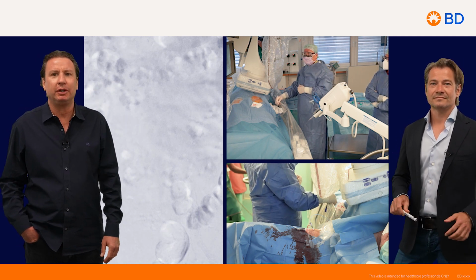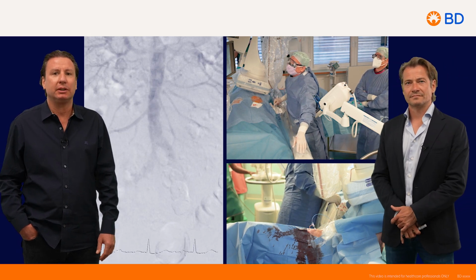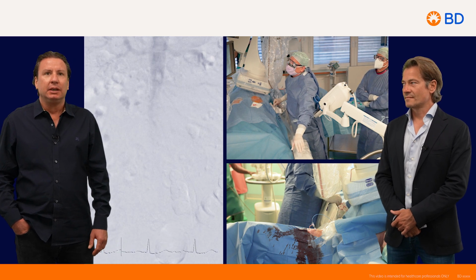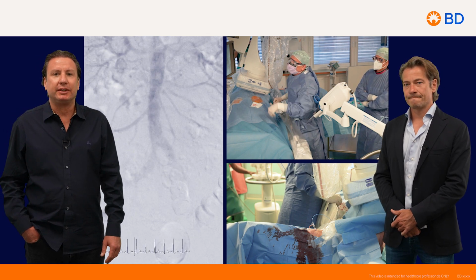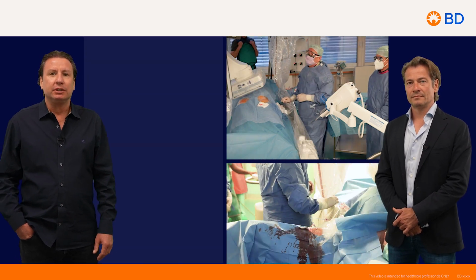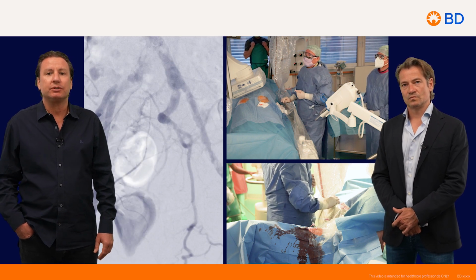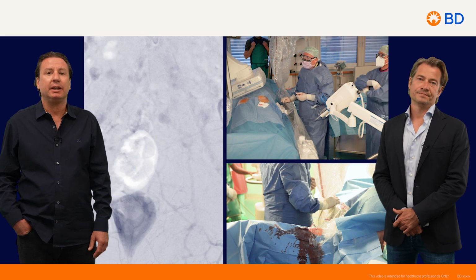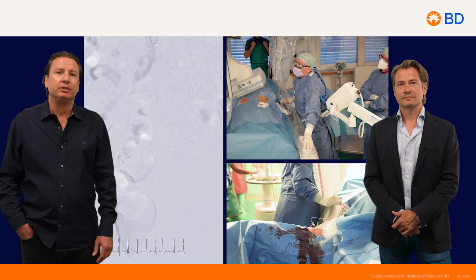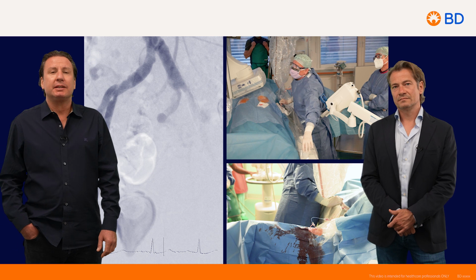He's very obese, by the way. He presented with acute symptoms with claudication on the left after only a short walking distance. He already had 3 stents implanted into the left SFA 6 years ago, and he had a re-intervention on the left side with DCB treatment of the in-stent occlusions or in-stent stenosis of the SFA, as well as implantation of an interwoven stent into the distal external iliac artery, as well as the common femoral artery on the left side. You see here the baseline angiography.